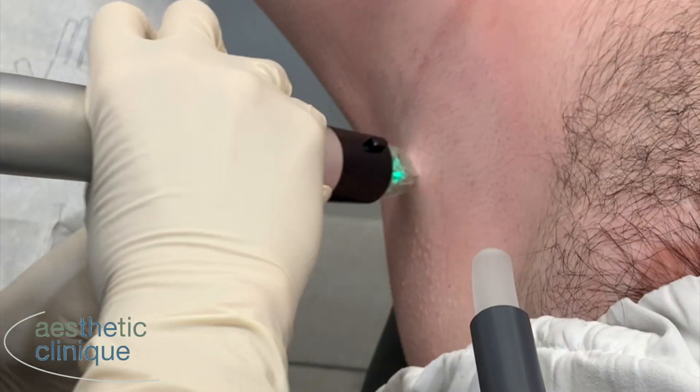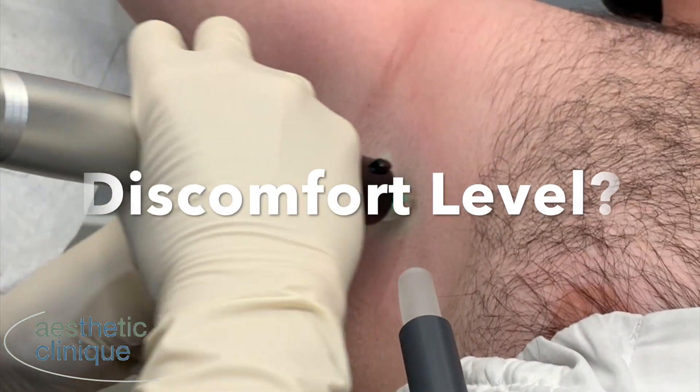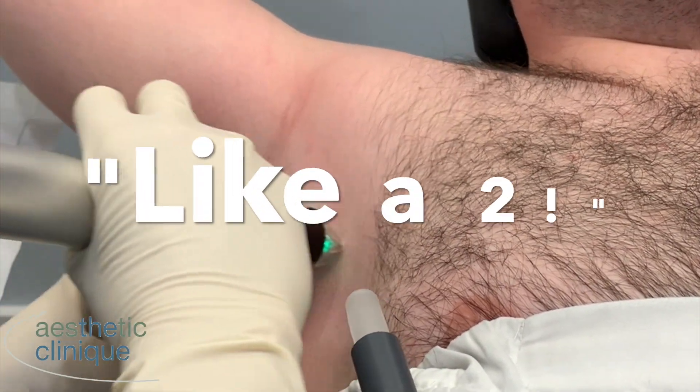What would you rate your discomfort that you're feeling right now with the Genius treatment on a scale from 0 to 10? 0 being no pain, 10 the worst. Like a 2.